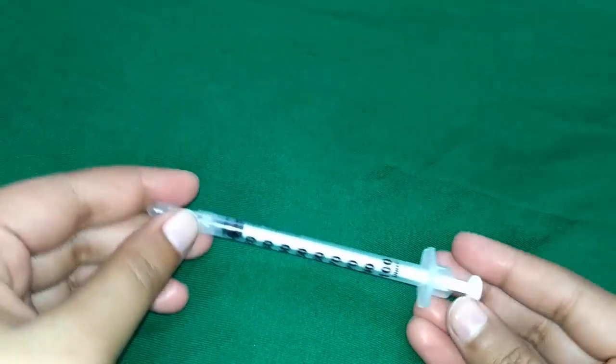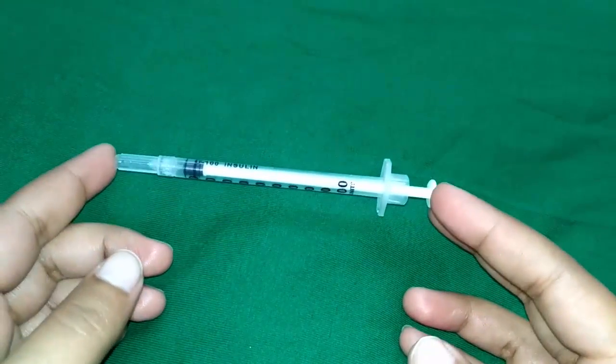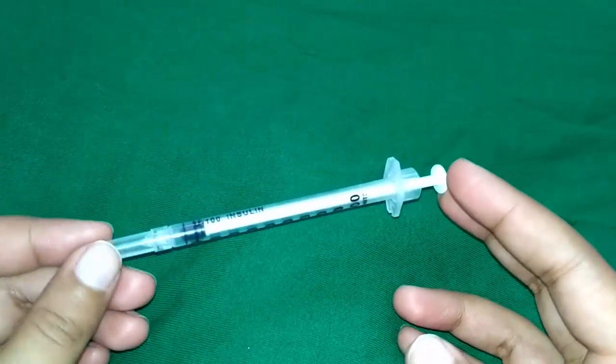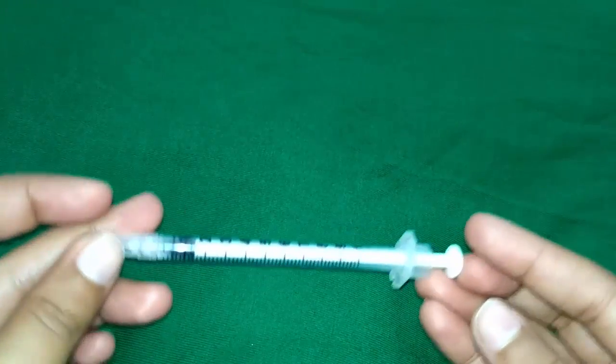Hello everyone, today I will be explaining about the insulin syringe. It is a special syringe which is graduated to 40, 80, or 100 units, hence it is useful to give insulin in the required units.